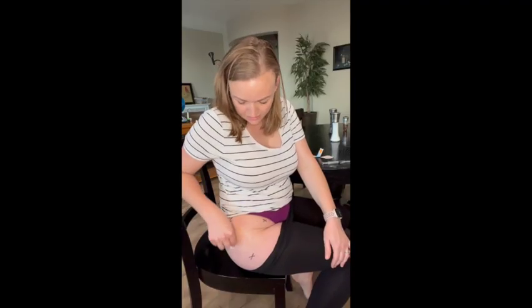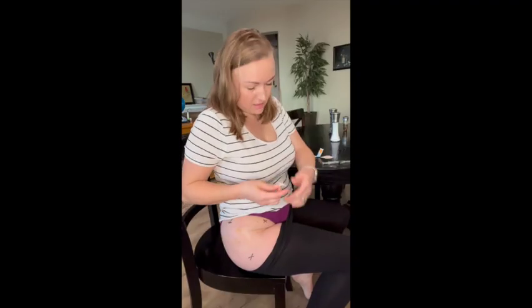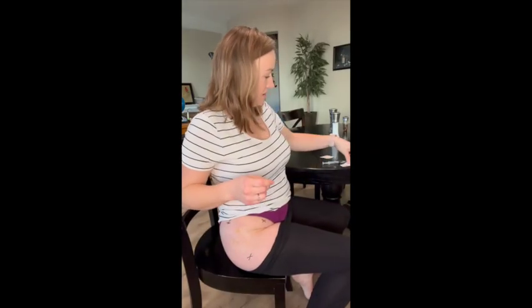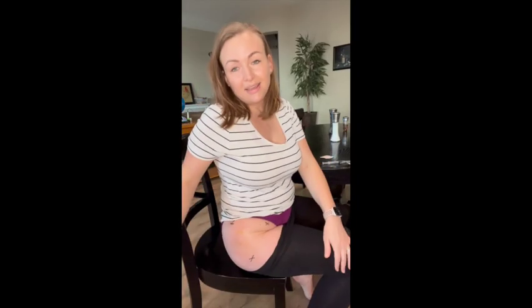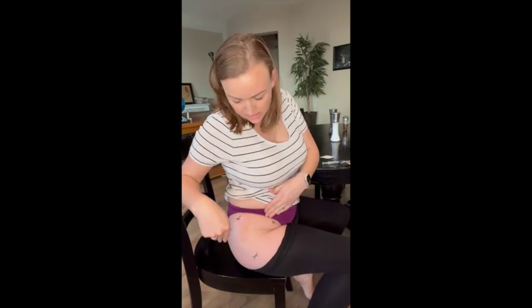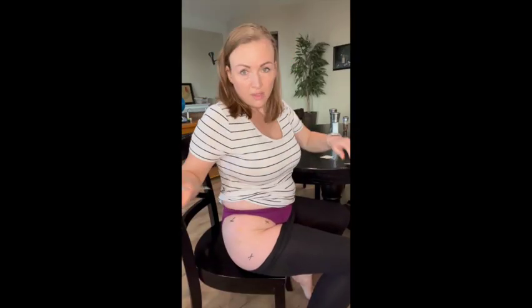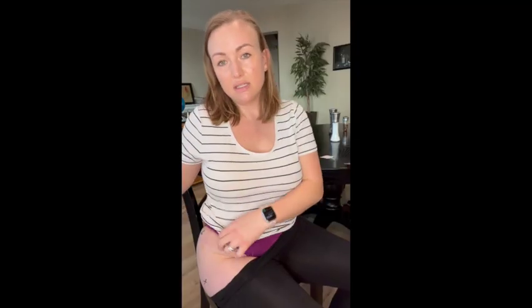I'm going to cleanse the site here. You might also want to have cotton balls nearby, because every now and then you might hit a superficial bleeding vein that does make it bleed a bit. As you can see, my bruising isn't too bad. So let me change my angle so you can see the actual injection. I've got my nice squishy spot, I've already sanitized it, so I don't want to touch it again.